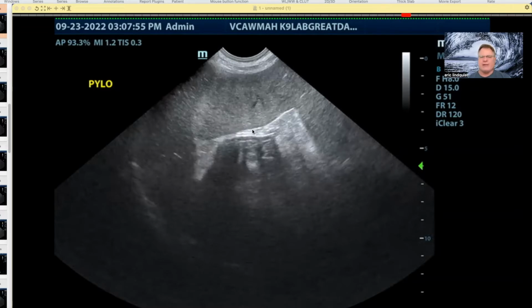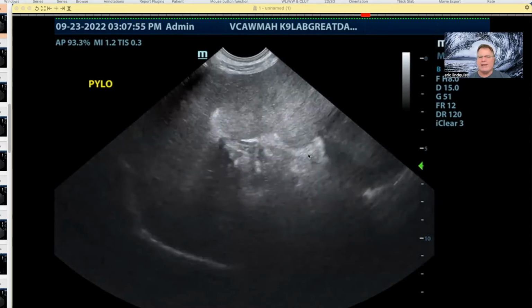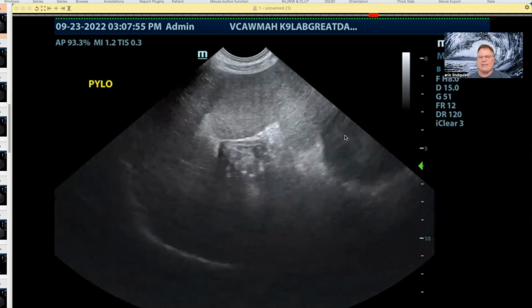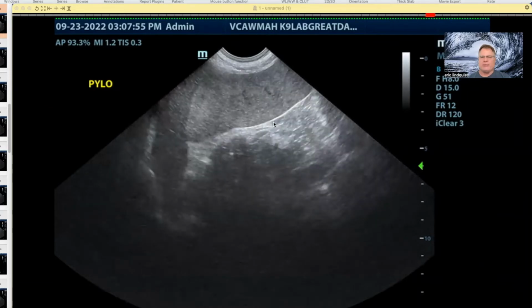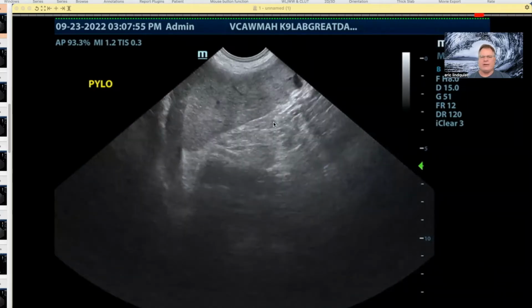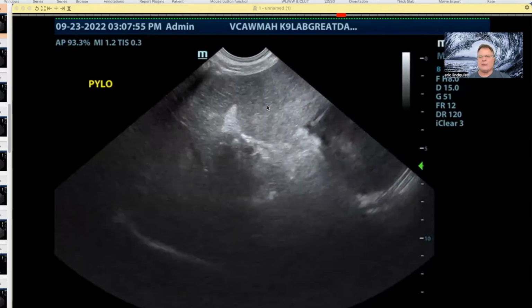But then we follow the capsule. I want you to watch the capsule, curvilinear theory here. As we watch, the capsule goes around the mass. Therefore, if I back up, I know this is the mass. What does this parenchyma belong to? If I back up and follow the capsule going around the mass, you see all this fuzzy fat because of adhesions, and upon the expansive pathology, the body's trying to wall off the pathology. And we follow the capsule back, and we get the splenic hilus. So we know that this mass belongs to the spleen.